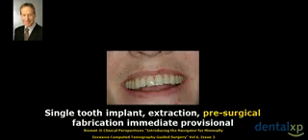It's somewhat ironic that the case that I'm showing you is exactly like the case that Scott showed you with the lateral incisors. Now, Scott didn't tell you why it was so great to pick that case. Basically, when he took the tooth out, there wasn't a socket. So he's no dummy. He understands that.